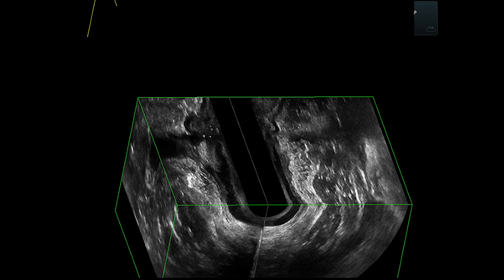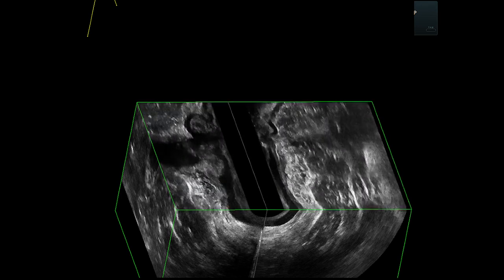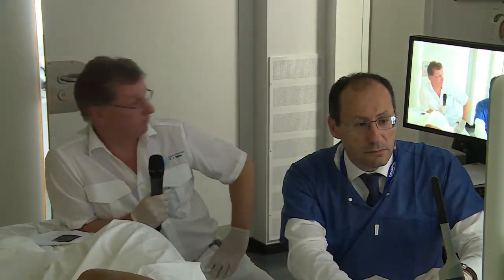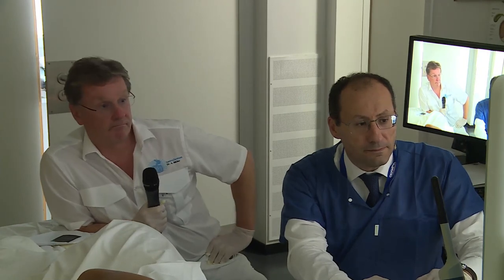Okay, many thanks. Are there any questions? Hopefully, because Professor Santoro will soon give his lecture. So I think this is a very interesting case. On the surgeon's side, it's quite challenging because you did the TaTME, transanal TME, already, so the plane is remaining. But if you dissect through the intersphincteric plane, you may be able to reach that lesion, right? Yeah. Thank you very much. A very nice case demonstration. Thank you. Yeah.